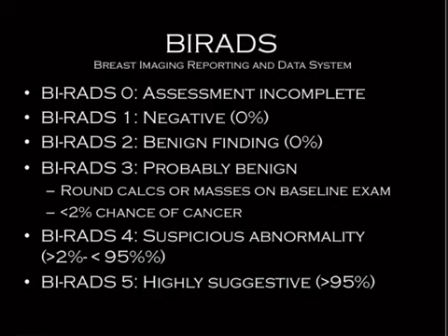And the other thing that's important between BIRADS 4 and BIRADS 5 is that if you BIRADS 5 something and you biopsy it, and then the pathologist tells you it's benign, you have to recommend surgical excision and a surgical biopsy. If you BIRADS 4 something and the pathologist tells you it's benign, then that's acceptable. So that's a concordant versus discordant pathology result. And you have to actually follow up your biopsy results, unfortunately. Now, there's also BIRADS 6, which is path-proven. I didn't include that in there.